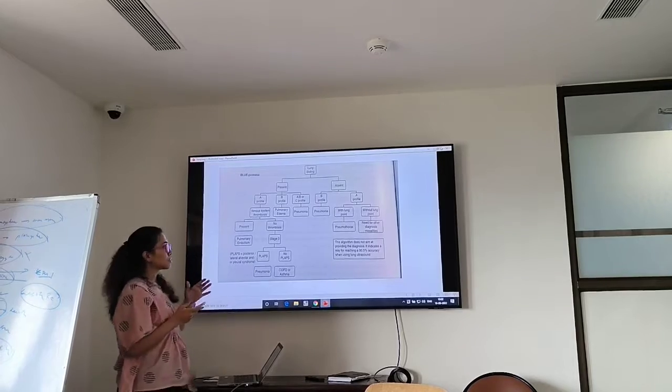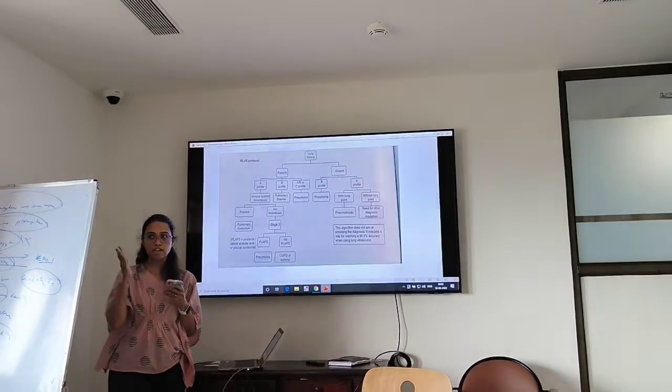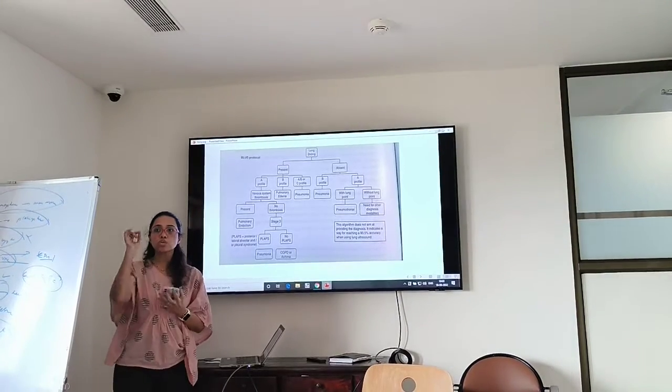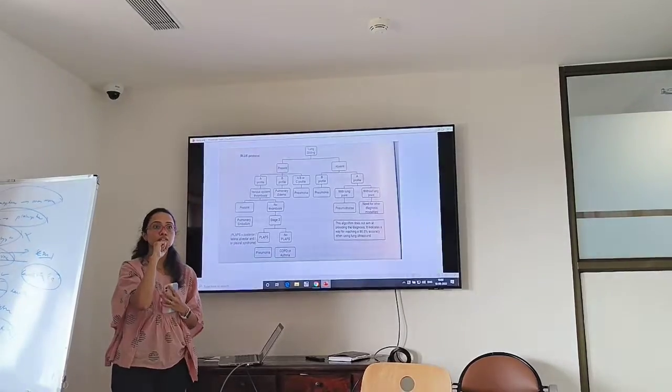There is something which is known as a blue point. We put both our hands on both sides of the chest. So the midpoint of the... No, it's not like that.